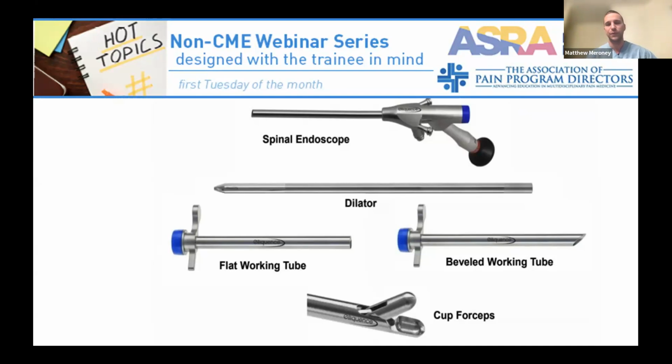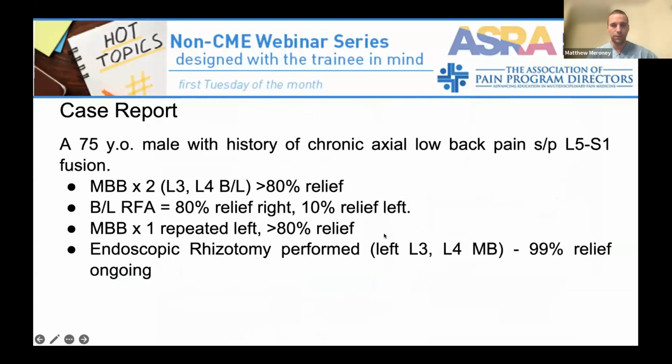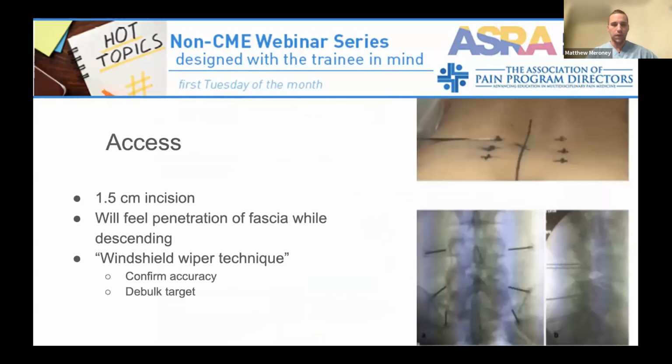It will initially feel gooey, like there's a lot of anatomy over the bone, and if you scrape it hard enough, you'll feel it get kind of gritty, and you can tell that there's just bone left. And you can arguably do a big portion of the ablation just with that tool. I've never stopped at that point, but I would bet that it does a lot of work. So you can really destroy tissue if that's what you're trying to do.